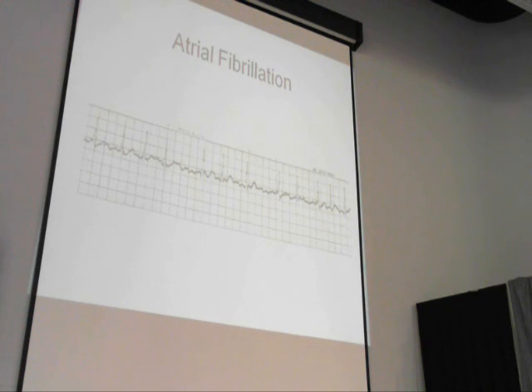The patient that requires cardioversion has a heart rate. It's a crappy one, a rapid one, a fast one that could get on the music bus if we don't stop it. But we cardiovert to calm down, slow down, and the most important point is they've got a pulse. We don't like it, we've got to fix it. Synchronized means we give them electricity at a point where the cardiac cycle and those waveforms are acceptable to it.